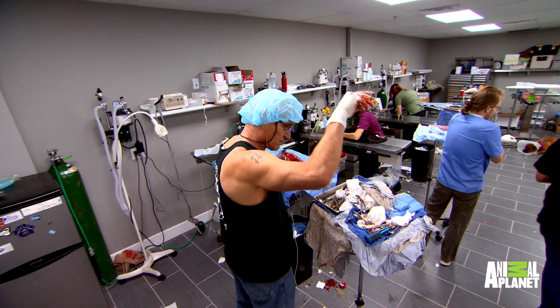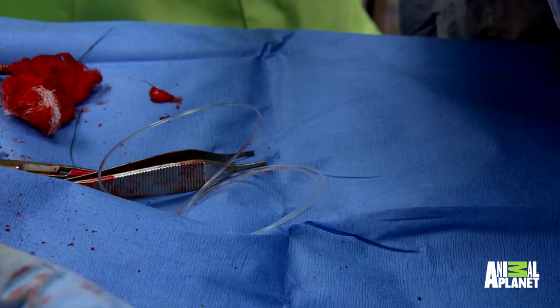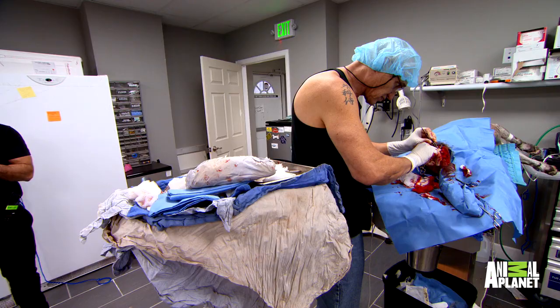Yep, there's the ACL. It's torn just like I suspected. I'm going to remove the little remnants and replace it with an artificial band.